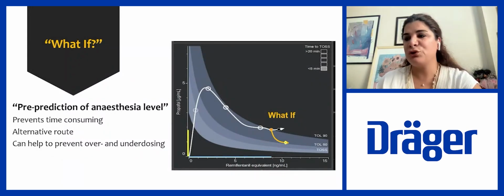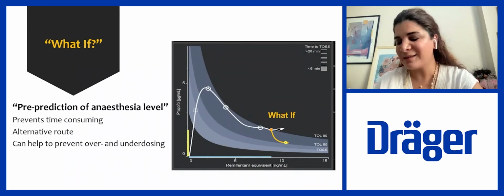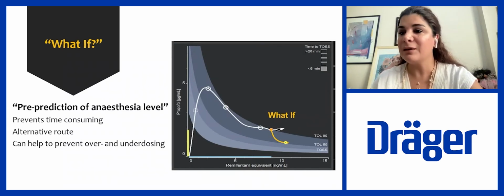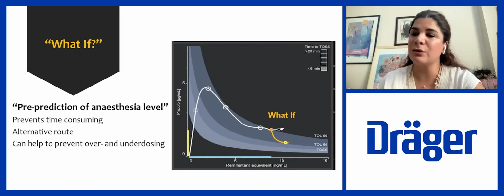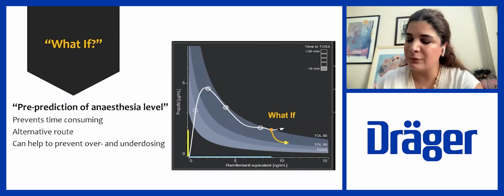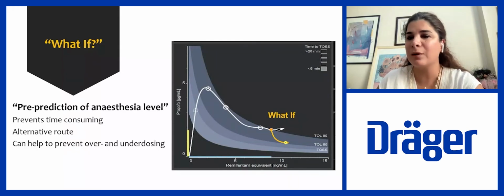This what-if feature is a very important feature for the SmartPilotView. It's just to try, if I give just an anesthetic, what will happen afterwards. The what-if display only takes account of the drug in question and not of any dependent drugs. It shows only each drug's pharmacokinetic effect. After a possible manual administration of a bolus is confirmed, the subsequently calculated pharmacodynamics may deviate from the former prediction.